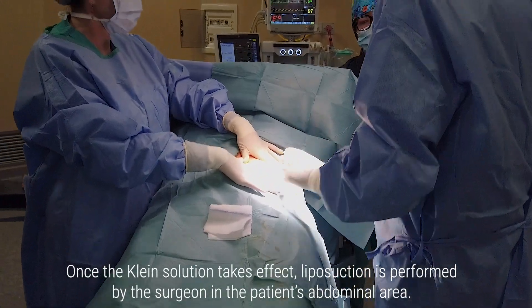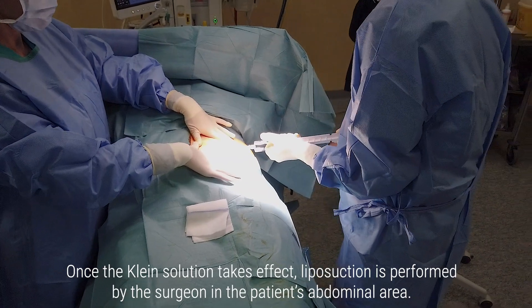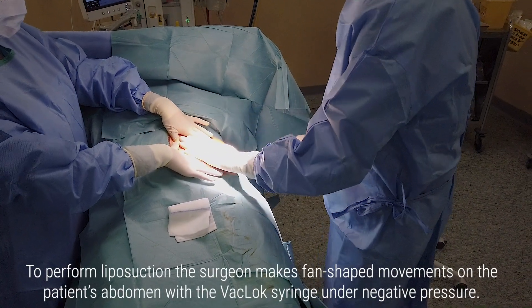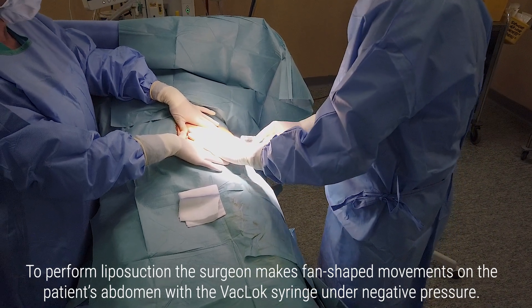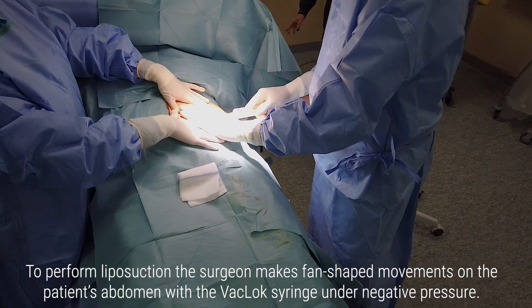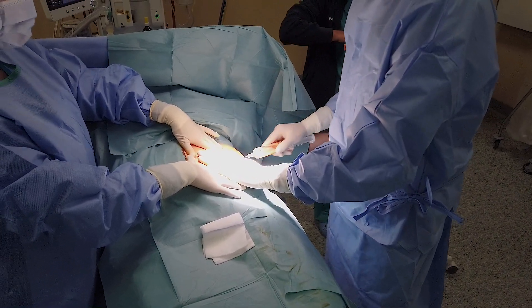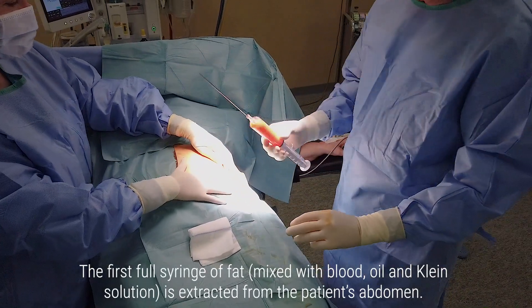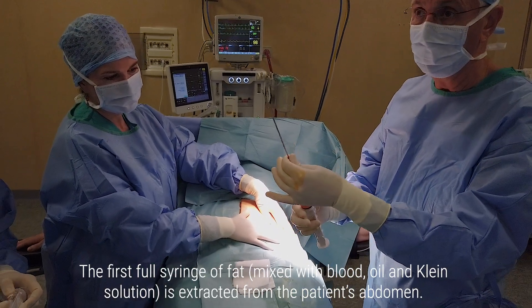Once the Klein solution takes effect, liposuction is performed by the surgeon in the patient's abdominal area. To perform liposuction, the surgeon makes fan-shaped movements on the patient's abdomen with the VacLok syringe under negative pressure. The first full syringe of fat, mixed with blood, oil and Klein solution, is extracted from the patient's abdomen.